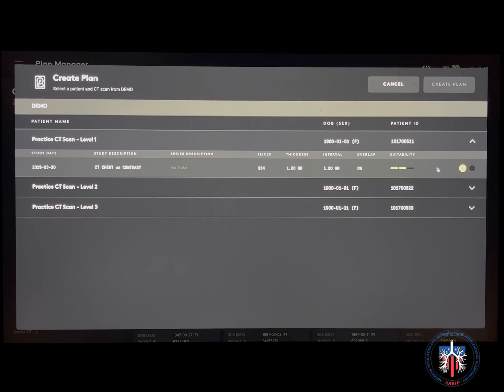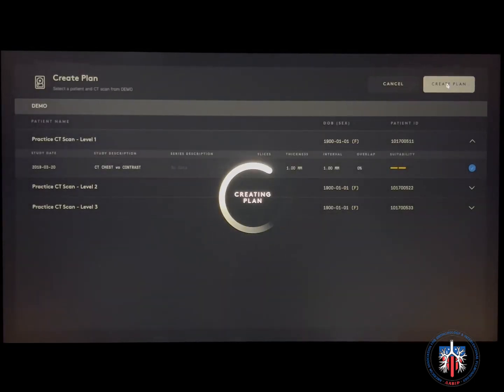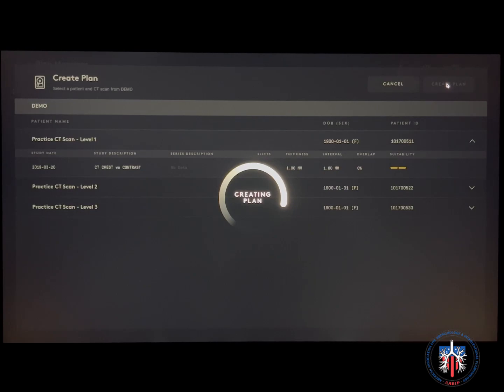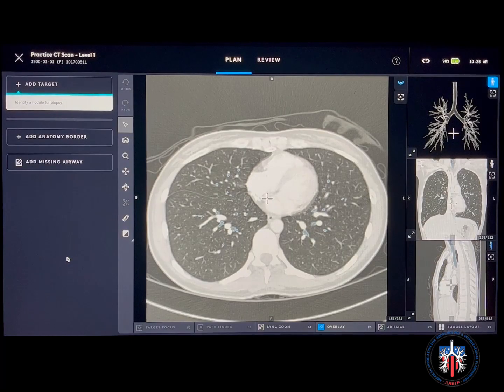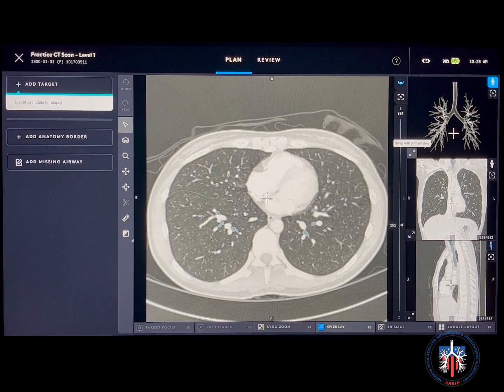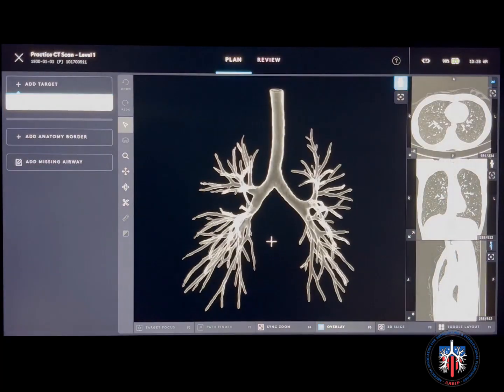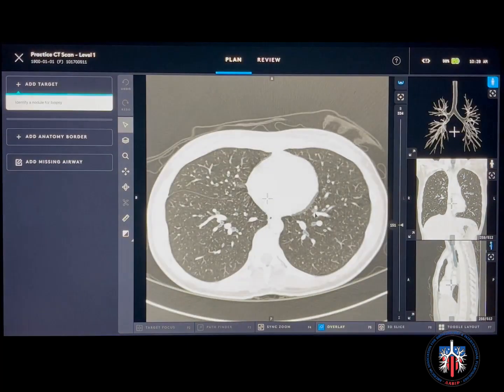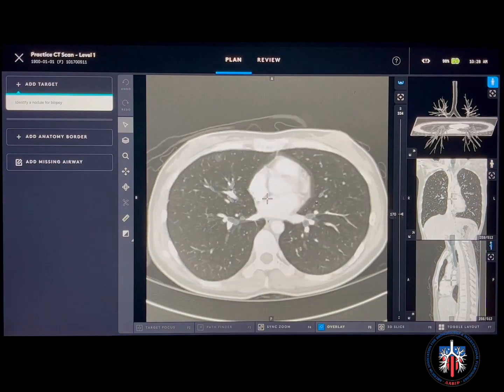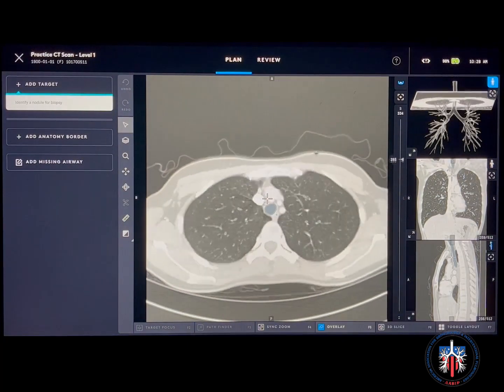Select the series, click create plan, and the CT scan will be loaded. The software uses the patient's CT scan to create a 3D airway tree of the lungs. Scroll through the slices to identify the target of choice.